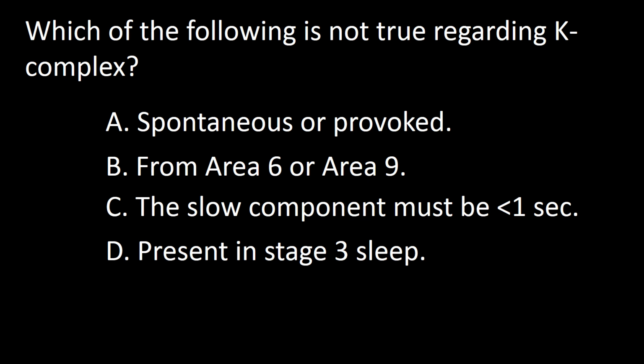A. Spontaneous or provoked. B. From area 6 or area 9. C. The slow component must be less than 1 second. D. Present in stage 3 sleep.